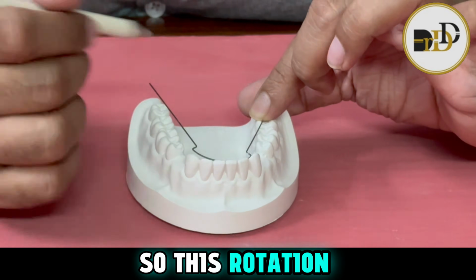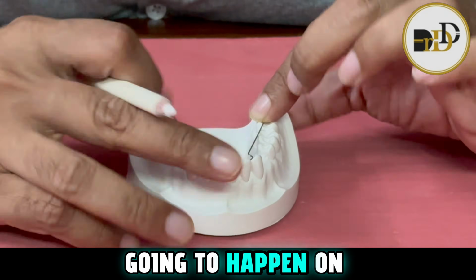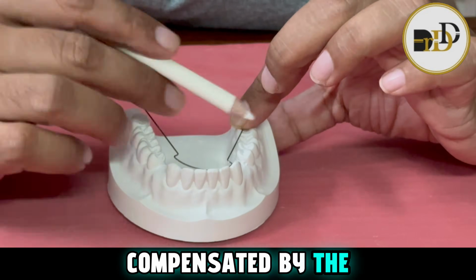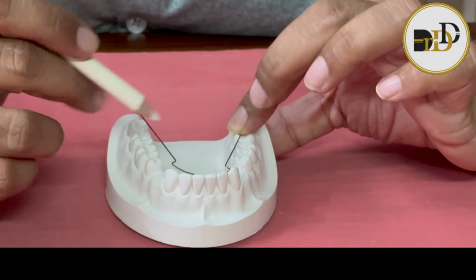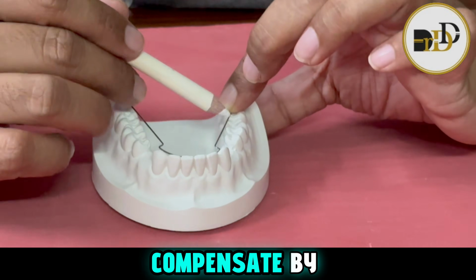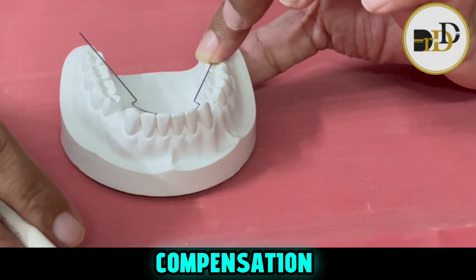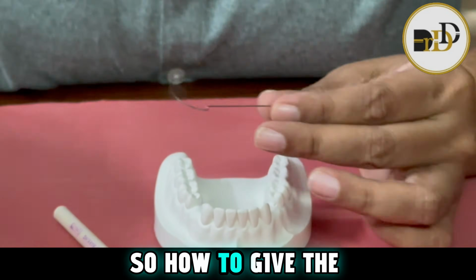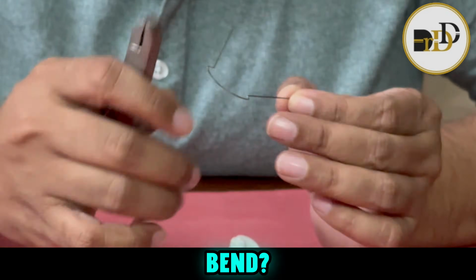This rotation tendency which is going to happen on the molar, we compensate by the horizontal compensation bend, and the mesial tip which is going to happen, we compensate by giving the vertical compensation bend. So how do we give the horizontal compensation bend?